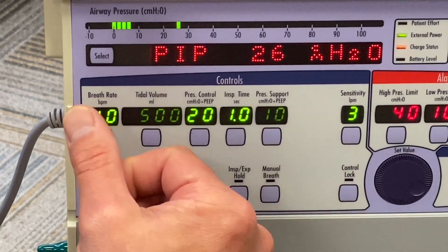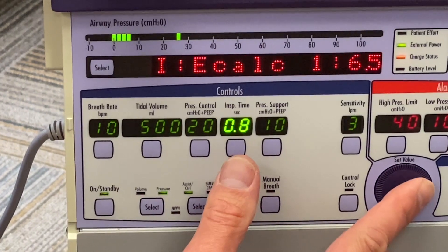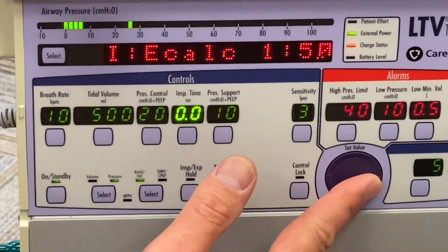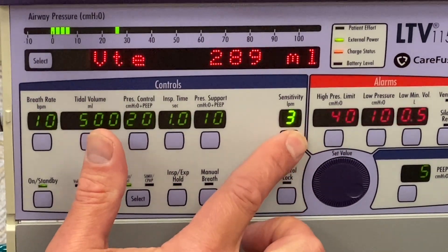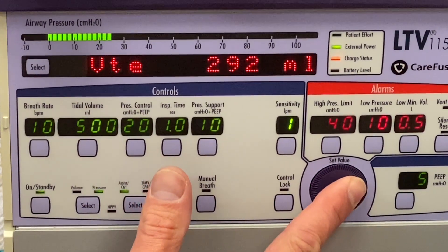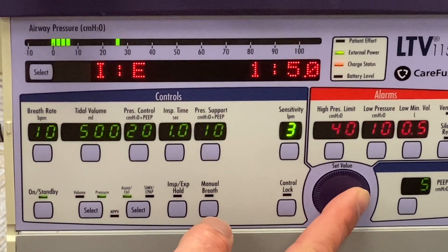Pressure control and inspiratory time function the same way — whatever you want to set it at, you control it here. You can also set your expiratory sensitivity right here. It goes from one to nine.